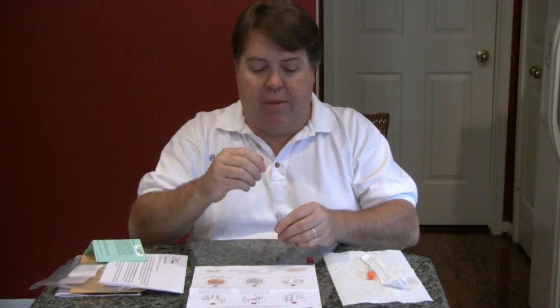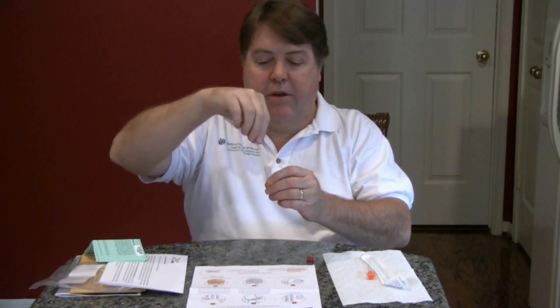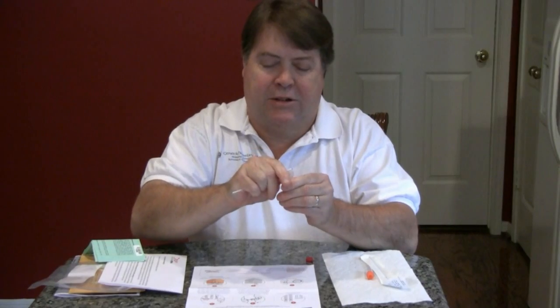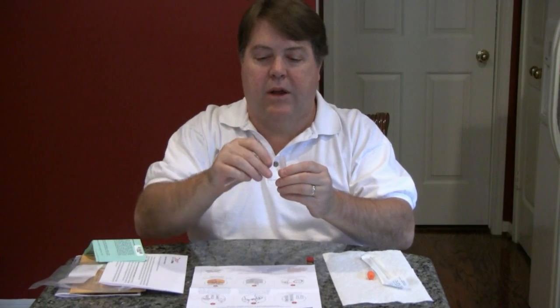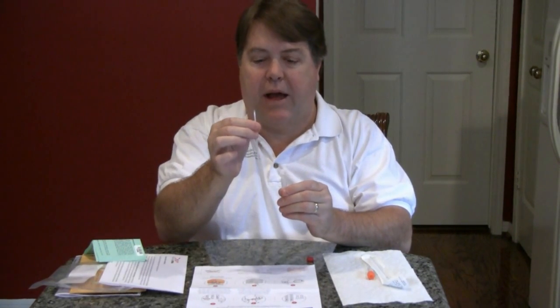Therefore, this technique demonstrates how to break the head off in the vial without anyone touching it. Put the swab head into the vial to about the level of the black line. Then, holding the vial firmly with one hand, start bending the handle until it snaps. It's going to bend a little bit first and then it should break at the black line.